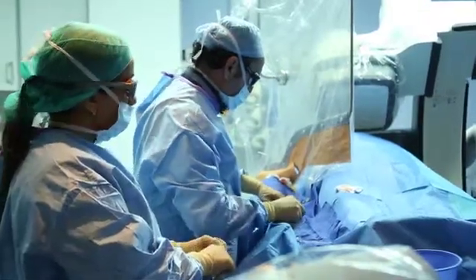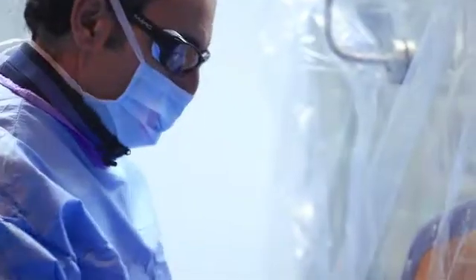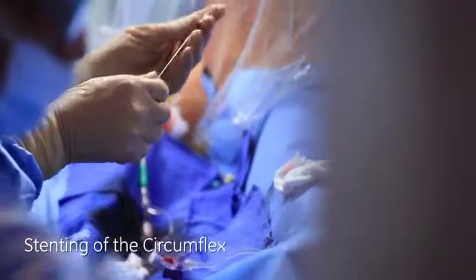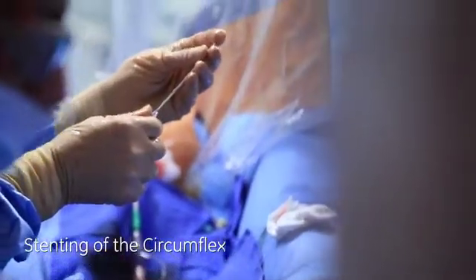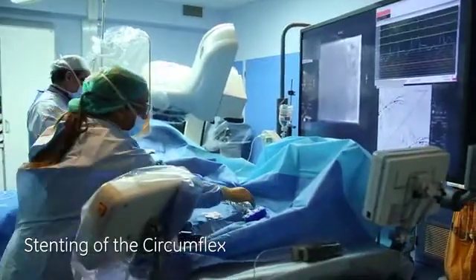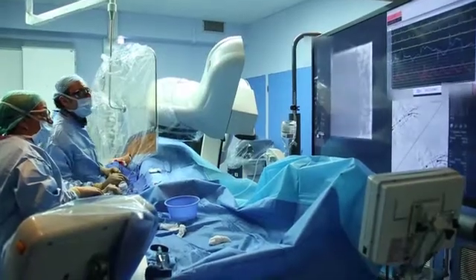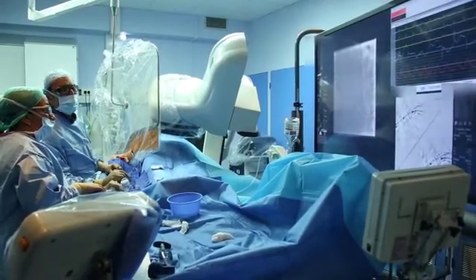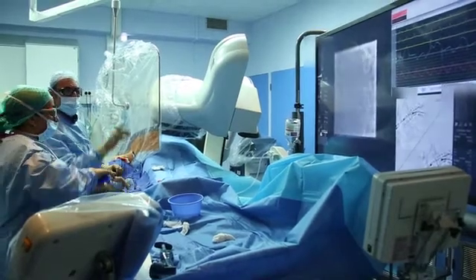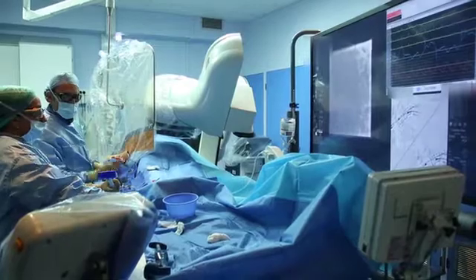To reduce the risk of thrombosis and to reduce the risk of major adverse cardiac events in the follow-up of this patient. We have to cross now the strut to go to the circumflex. We crossed with the balloon the struts of the left main, so we are going to open the strut of the circumflex now.